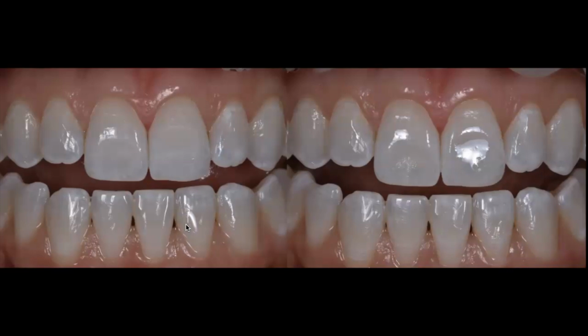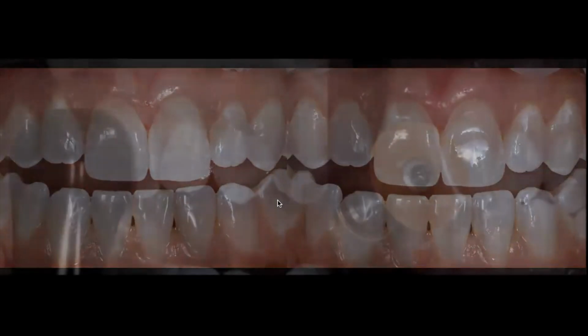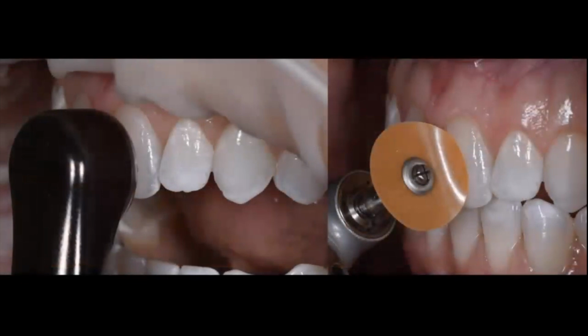Once you light cure the first layer, you're going to apply a second layer, because as you know, you're going to have some oxygen inhibited layer on that final layer. You want to make sure that you cover it as much as possible, and then you light cure a second time. So each layer is cured separately. The first layer is the most important one. That's the one where you really want to take your time, 30 to 40 seconds, saturating that area multiple times, just making sure that the unfilled resin is absorbed in those micropores created by the acid, and then eliminate the excess, light cure, apply a second layer, and light cure again.